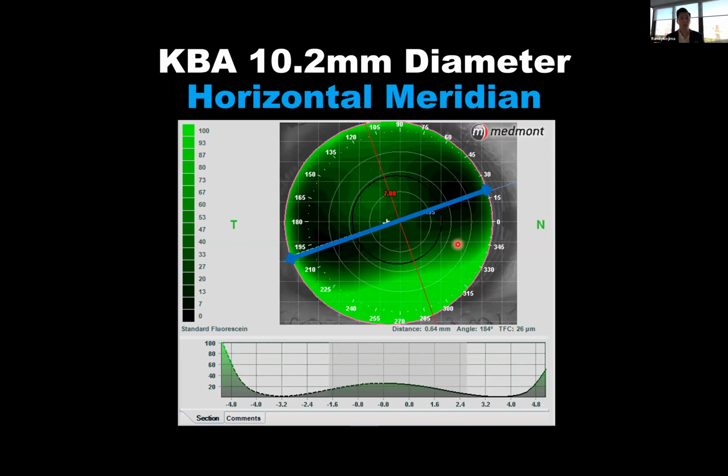So one of the ways that you can approach the irregular cornea is with a dedicated irregular corneal lens. And I know you're very familiar with that. I've been to Saudi a number of times, and I've seen some of the challenging irregular corneas that you face in the Middle East. So how do we best fit these eyes?